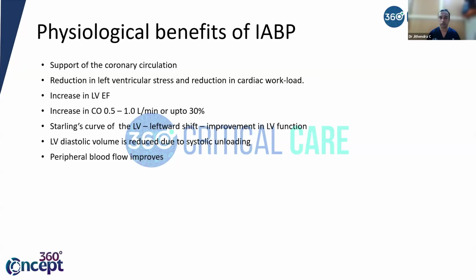We all know it improves the coronary circulation. There is a reduction in LV stress and reduction in LV afterload after deflation at systole. So there is a sudden giveaway. That will facilitate the LV. The workload suddenly comes down. That will facilitate the heart to work, mainly the LV. So there is an increase in LV ejection fraction because the afterload comes down. The LV ejection fraction becomes better.